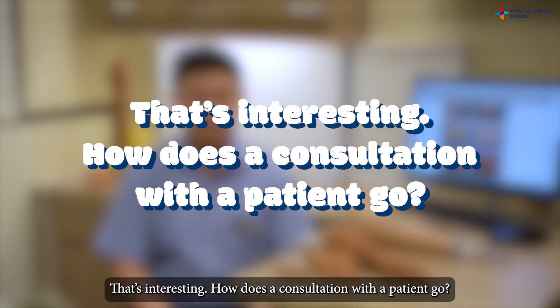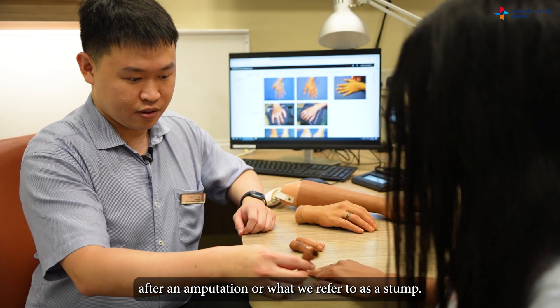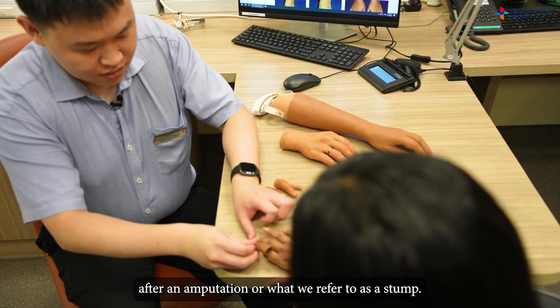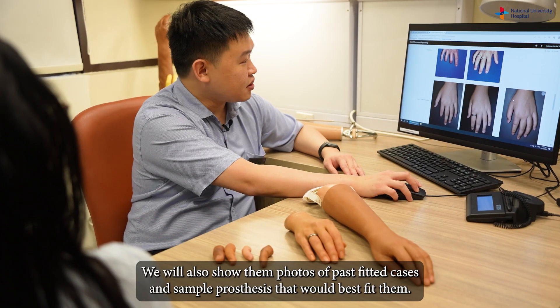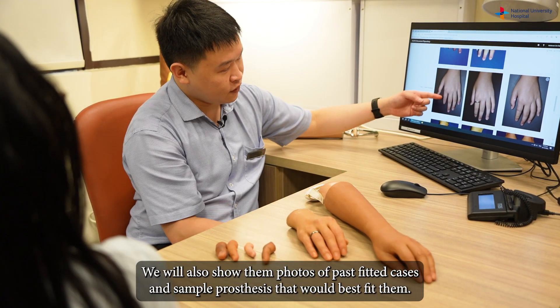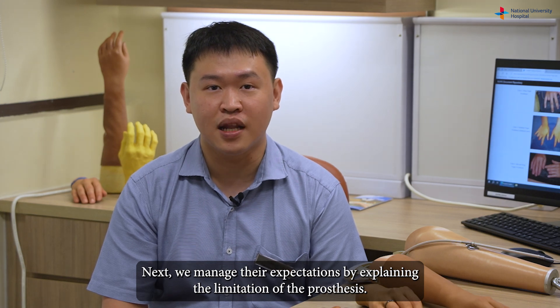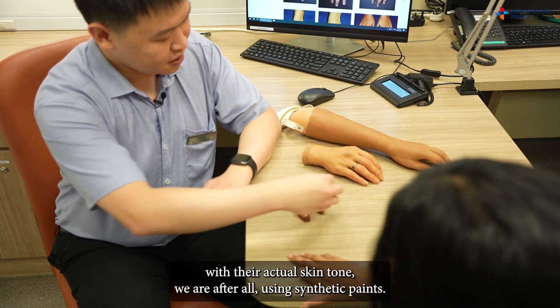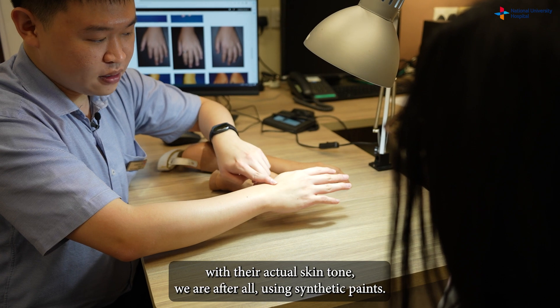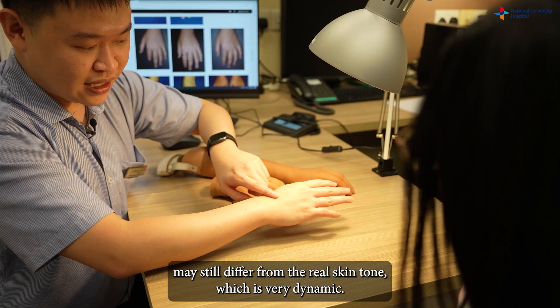During the first consultation, we assess the area that remains after an amputation — what we refer to as the stump. We then recommend the appropriate type of prosthesis for the patient and show them photos of past fitted cases and sample prostheses. Next, we manage their expectations by explaining the limitations of the prosthesis. Even though we try our best to match the colours with their actual skin tone, we are, after all, using synthetic paints, and the colours may still differ from the real skin tone.